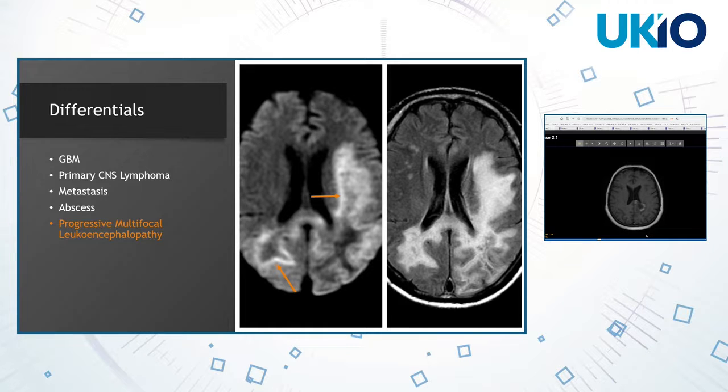So, they were planned for surgery because thought to be a MET or a GBM, and it's only at the pre-op planning scan that it's picked up as having reduced in size, for example, since the initial presentation, which helps to confirm the diagnosis.